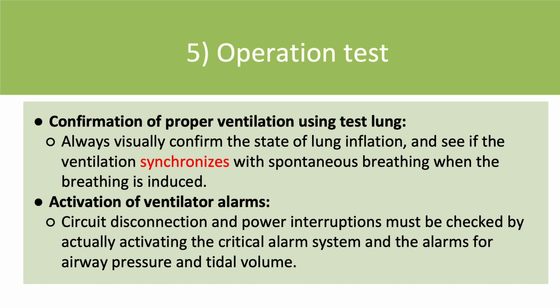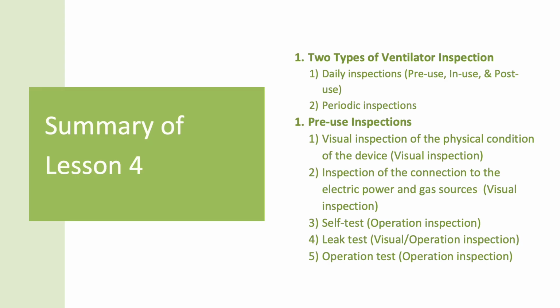It is important to have the ventilator ready for immediate use because the patients in need of mechanical ventilation are usually in critical conditions. However, it is also important to perform a pre-use inspection thoroughly to ensure safe use of the device. This is the end of Lesson 4, Pre-use inspection of the ventilator. Make sure you've mastered the basic concepts before you move on to the next level.